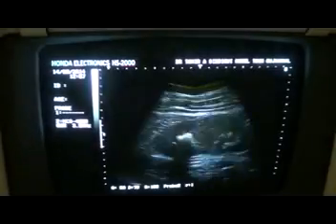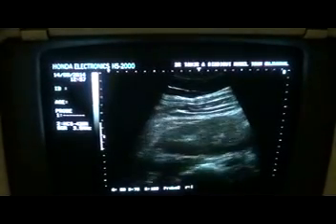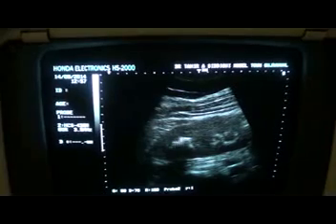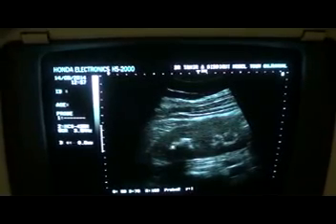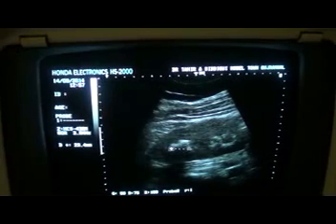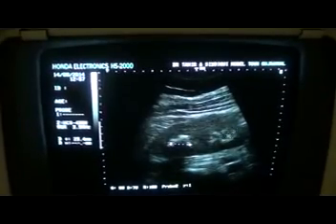Now you see that this is the longitudinal section of the right kidney, and what's seen is that there are three calculi, 1, 2, and this is the third one. This is the upper pole of the right kidney, and in total, because they are almost matted together, the measurement of the calculi is approximately 2.34 centimeters, and these are the minimally dilated lower pole calyces.